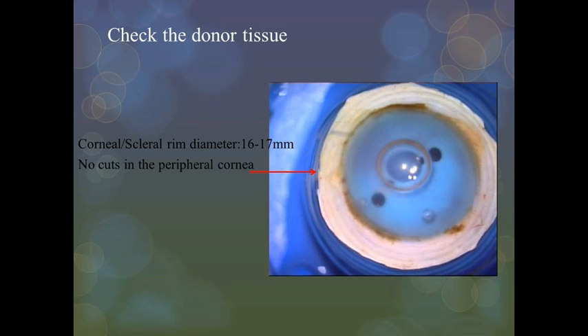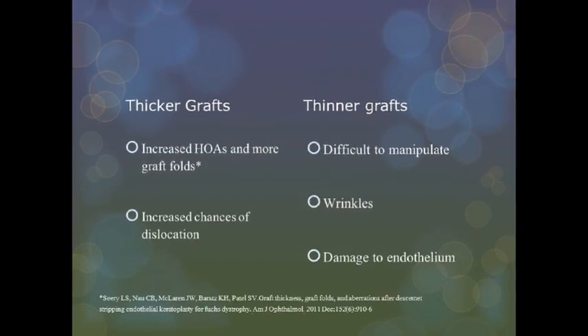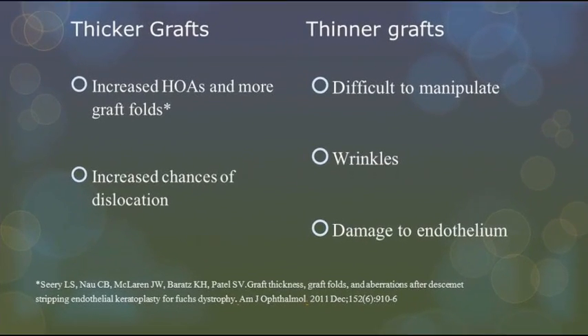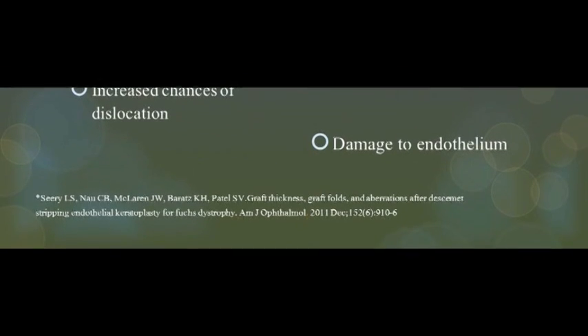Before starting the dissection, always check the donor rim diameter, which should be at least 16–17 mm, and there should be no cuts in the peripheral cornea. Always remember that donor tissue thickness can vary from 500 to 750 microns. Ultrasound pachymetry can be helpful in estimating the donor tissue thickness. Thicker grafts can have increased higher-order aberrations in the post-operative period, while thinner grafts are difficult to manipulate and can have wrinkles.